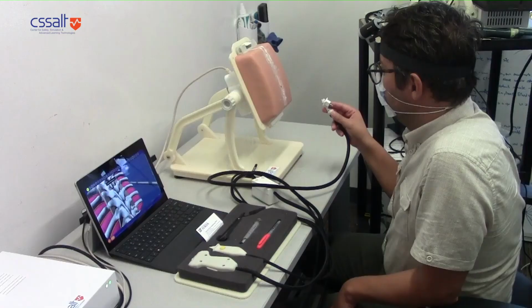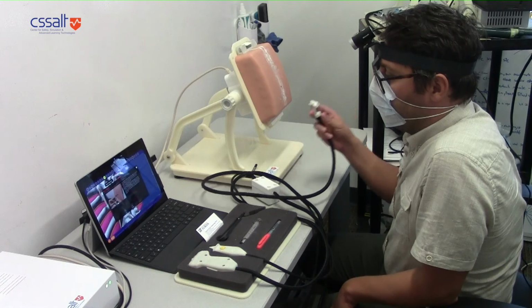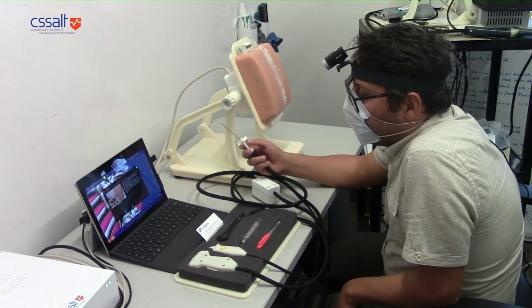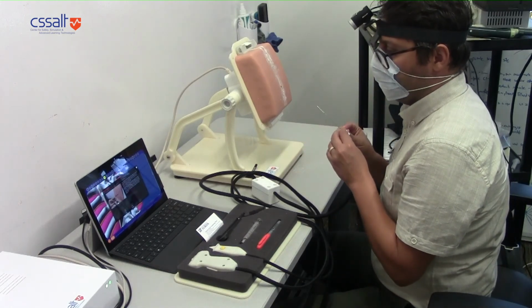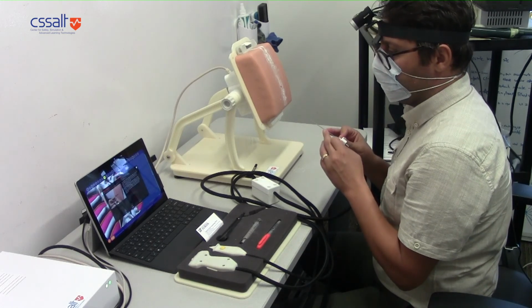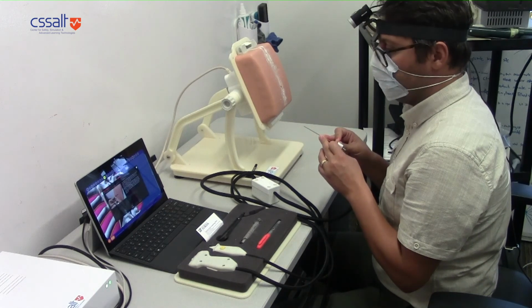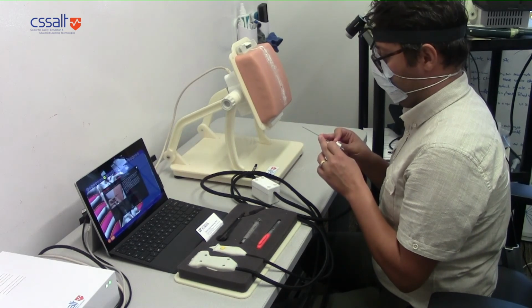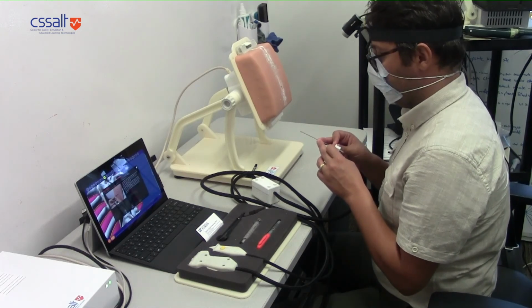Yeah. So, okay. So actually, I'm going to play this video right here. And you see, oh, actually, I don't have to play it. You see how he's holding the needle? Those little wings on the side, they allow you to hold the needle. And what he's doing is he is pinching the needle at a depth that corresponds to injury.